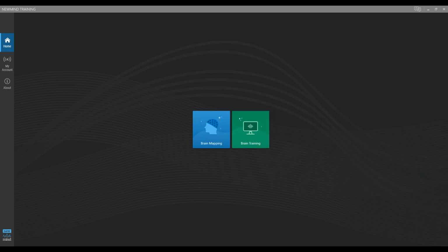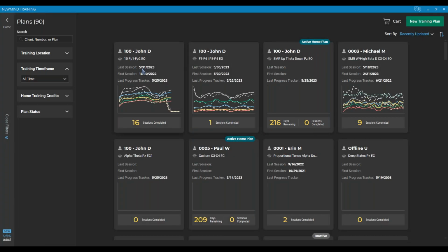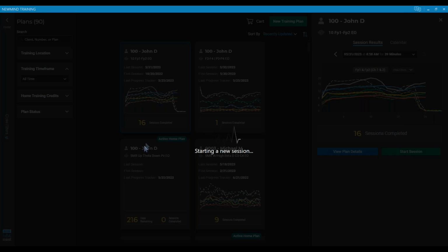They thought it would be really cool if their clients could get a little massage while they were doing neurofeedback, to keep them relaxed, which was a good idea in theory, but in practice, all those little motors humming away were causing massive electrical interference, and the client was actually sitting on top of all those motors. So you want to make sure you don't have any power in the chair itself. If you've got a power recliner, I would definitely do that, as well as unplug it.